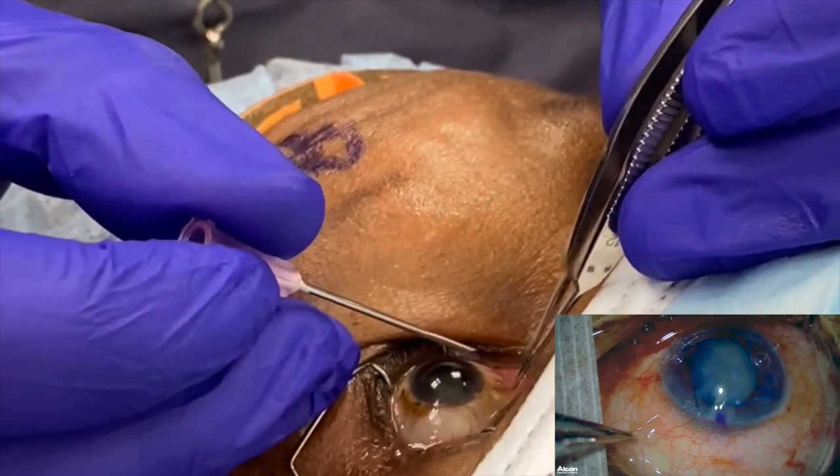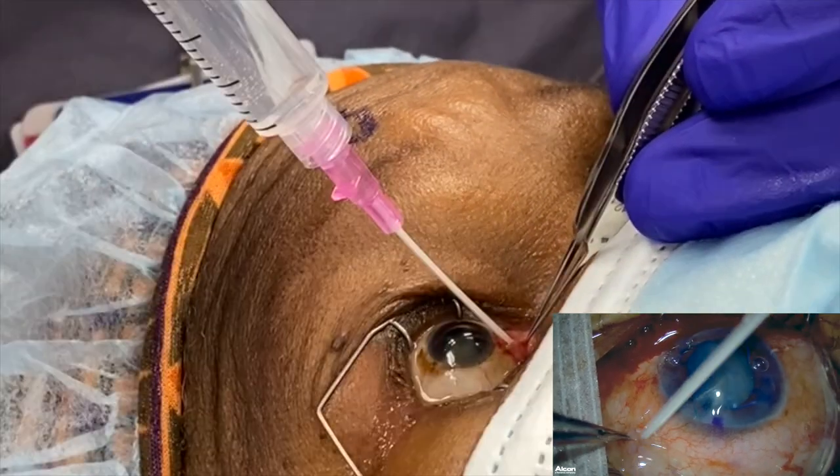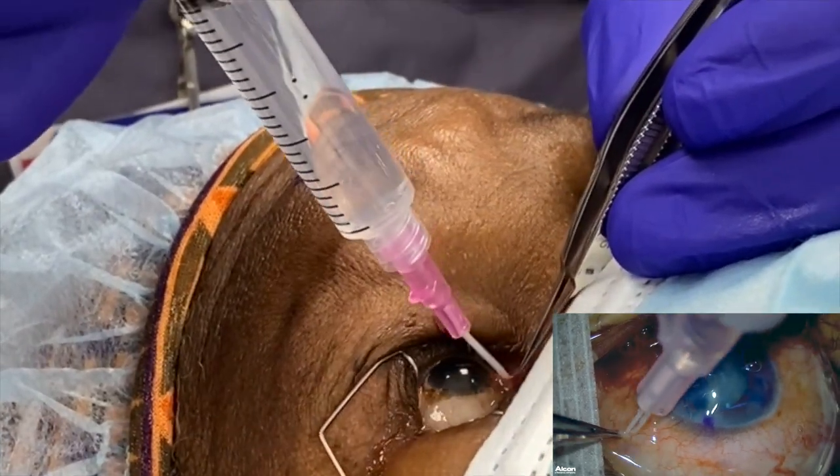Hold the Tenon's and the conjunctiva, make a nick with the 18-gauge needle, bevel down, then tuck the 20-gauge angiocath and inject slowly.